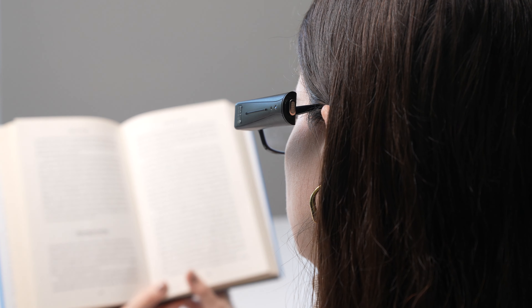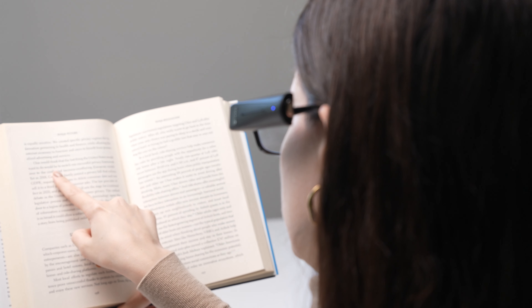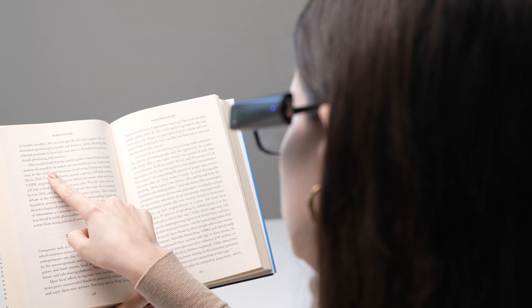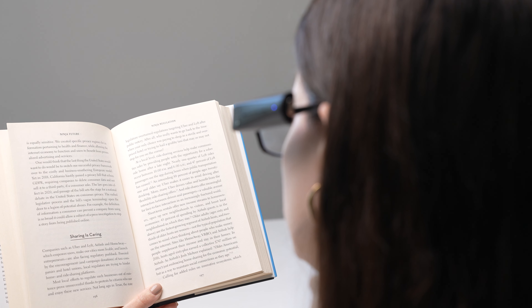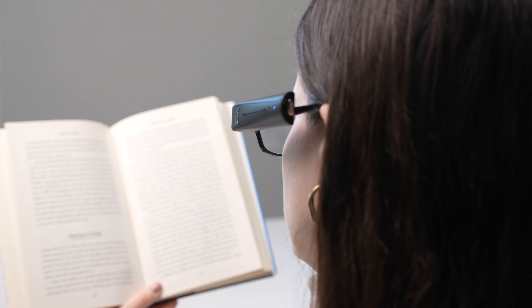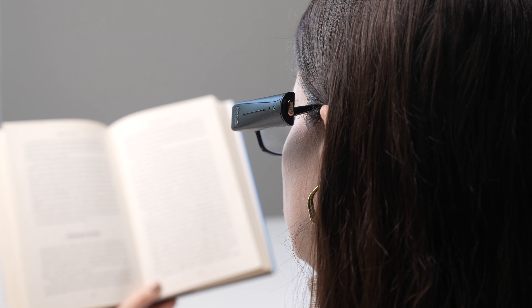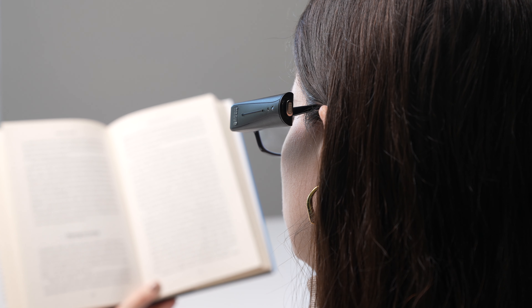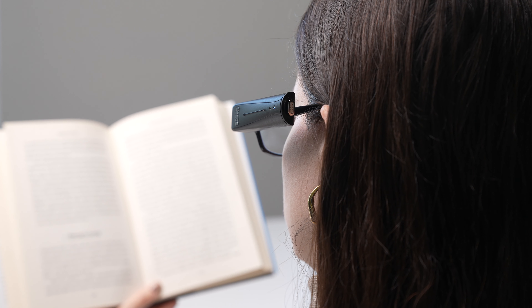The device will ask you to point toward the text you want to summarize. Press the trigger button to capture an image of the text. The device will process the text and read the summary out loud. The text discusses the concept of expanding on freedom and creativity. Note that this feature requires an active internet connection.